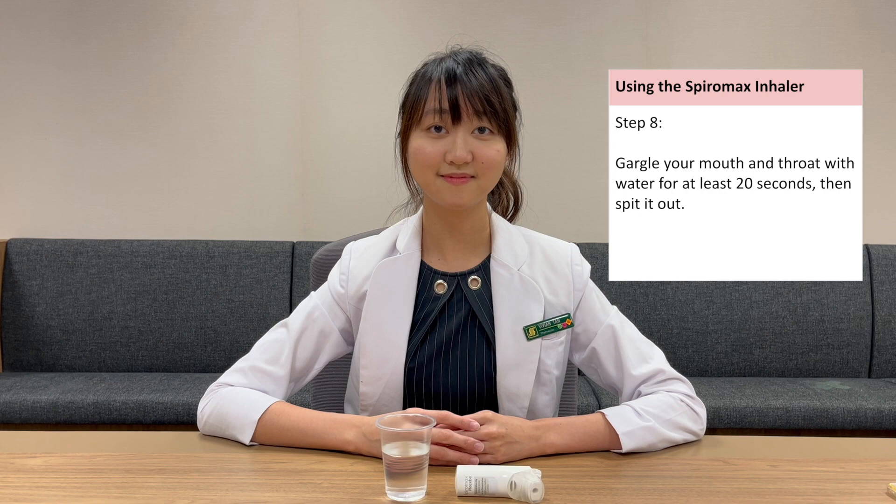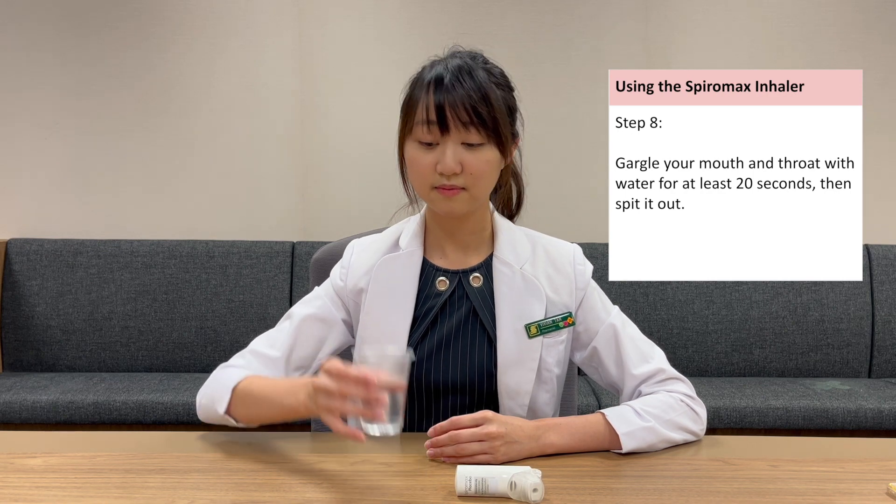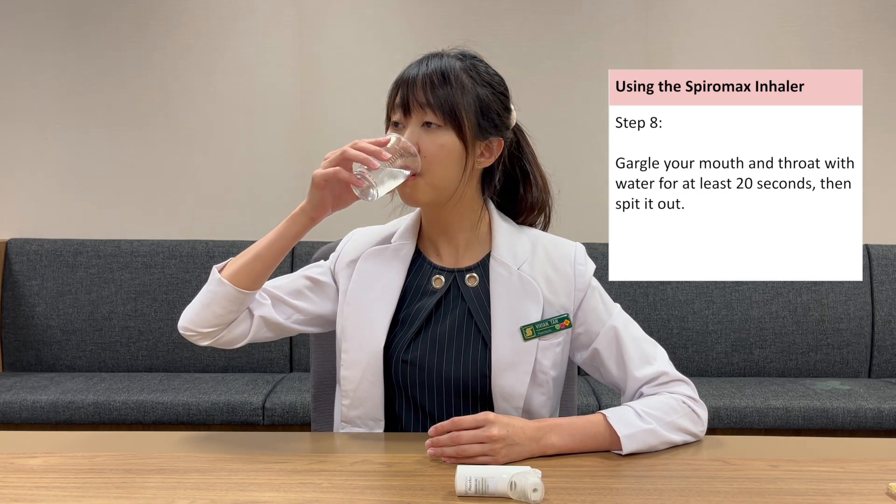Gargle your mouth and throat with water for at least 20 seconds, then spit it out.